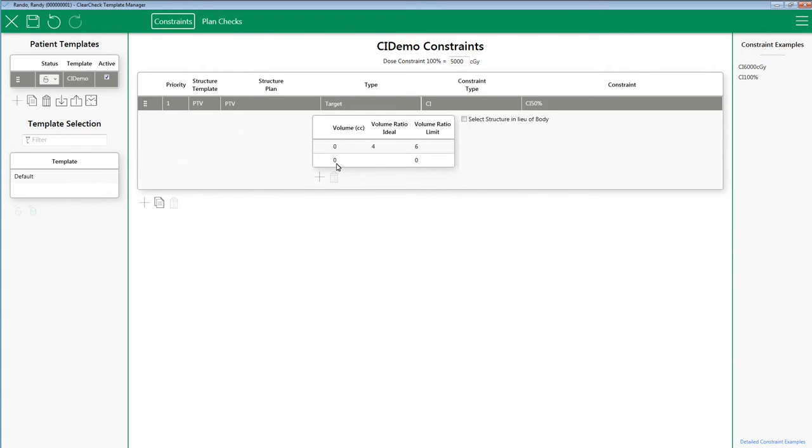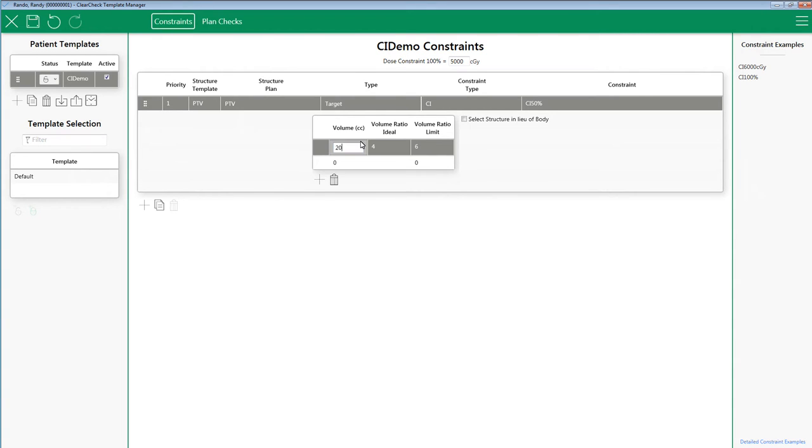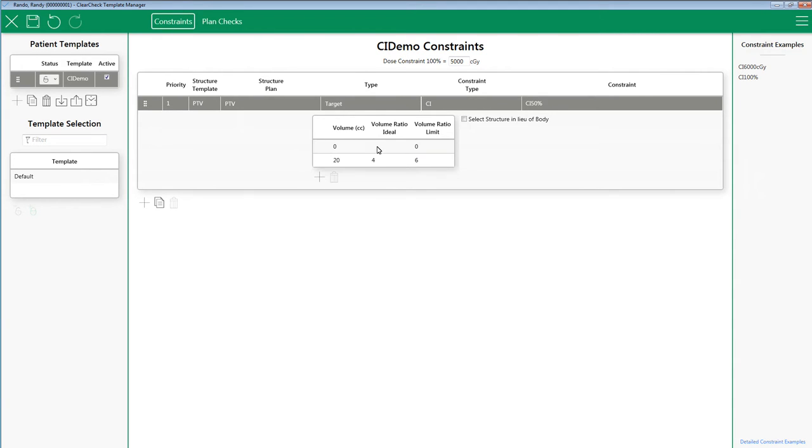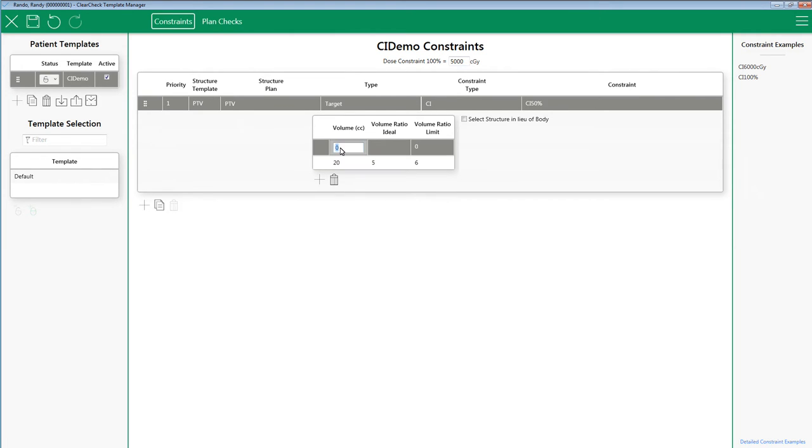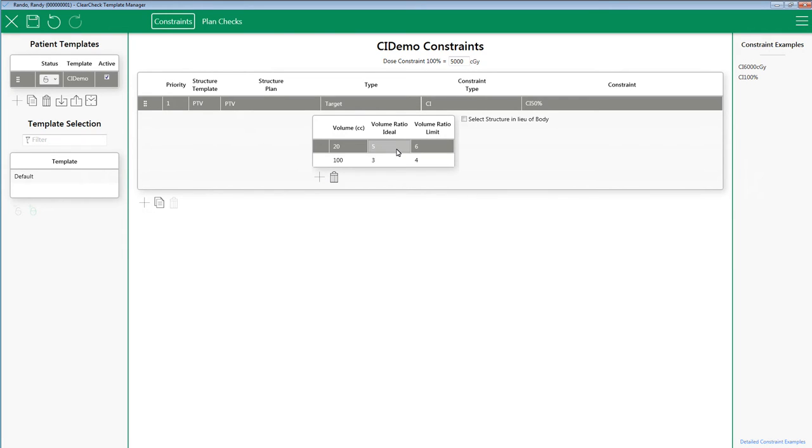So for example, if you have a target with 20 CC, maybe you only accept ideally 5 and have a limit of 6. If the target is 100 CC, maybe you only accept ideally 3 and have a limit of 4.